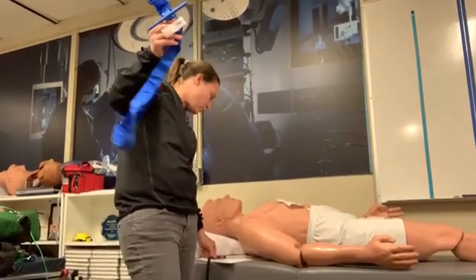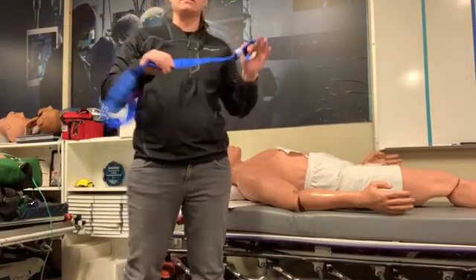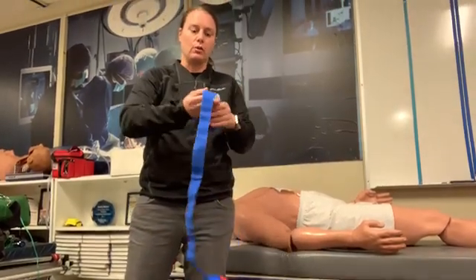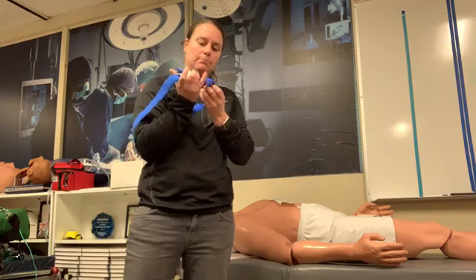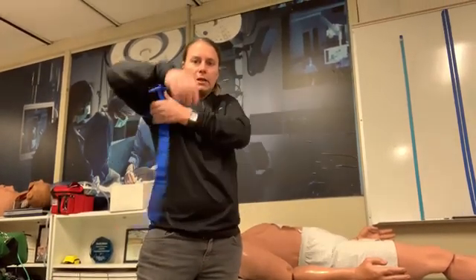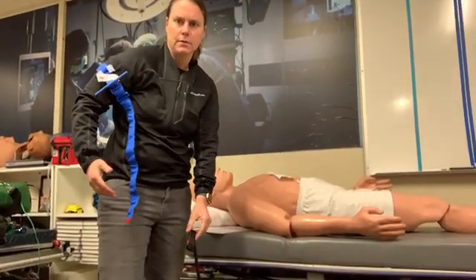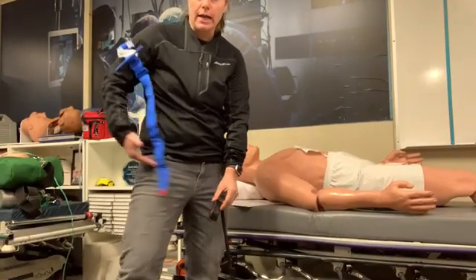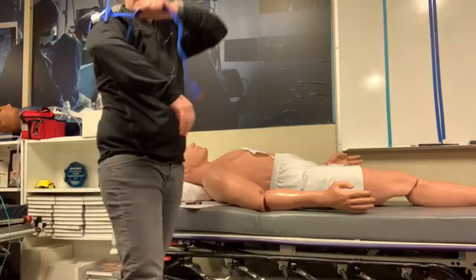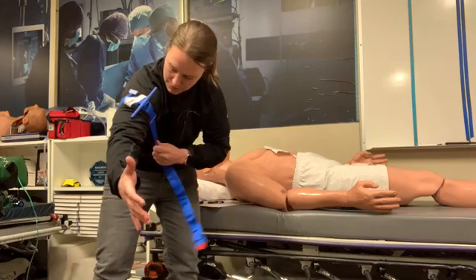The steps say to obtain a commercial tourniquet from the supply bag. And they do, even on this, say to place it as high as possible, which again is how I prefer to teach that. So this is going to go on as high as you can. On the arm, I'm getting as high up into that armpit area as I can. If I were to do the leg, you're coming up into that groin area as tight as you can get this. So you might need to lift their leg or shimmy this around a little bit to get this on there. And then this part goes as tight as you can pull to begin with, okay?